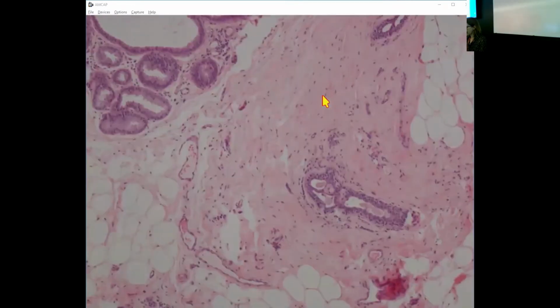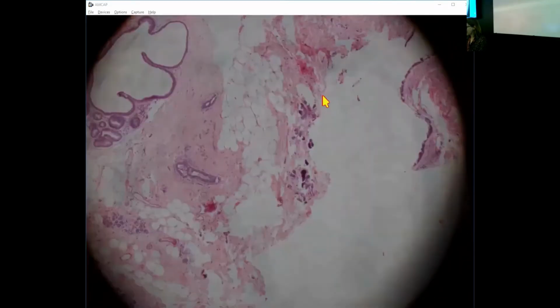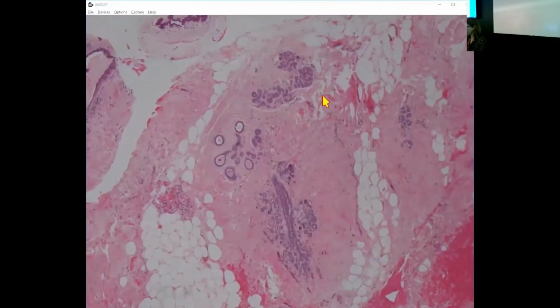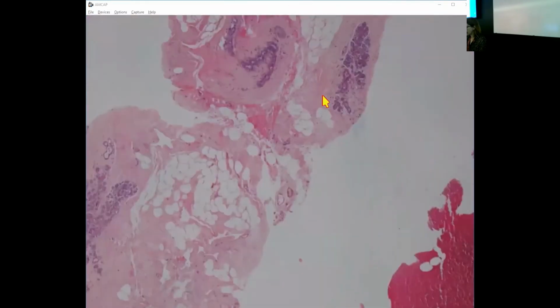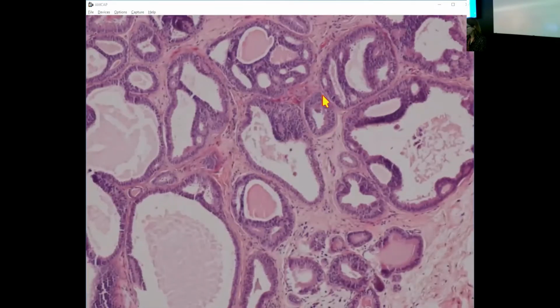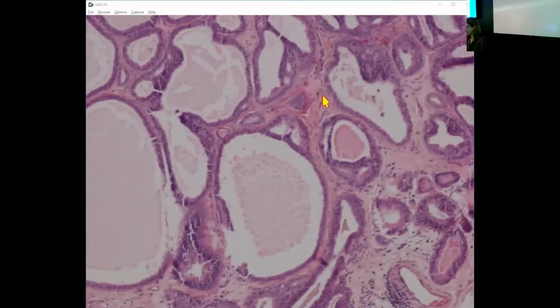So I think one of the things about FEA is, mostly in the picture books, we think of it as being quite a hyperchromatic, more bluish proliferation, but sometimes, depending on the staining, it can look quite pink. So ruling out an apocrine entity, you'd want to make sure there's no granules. You'd look at the NC ratio. Obviously here we've got frank atypical ductal hyperplasia. Now we've got good rigid bridges and spaces, but still some flat epithelial atypia as well.